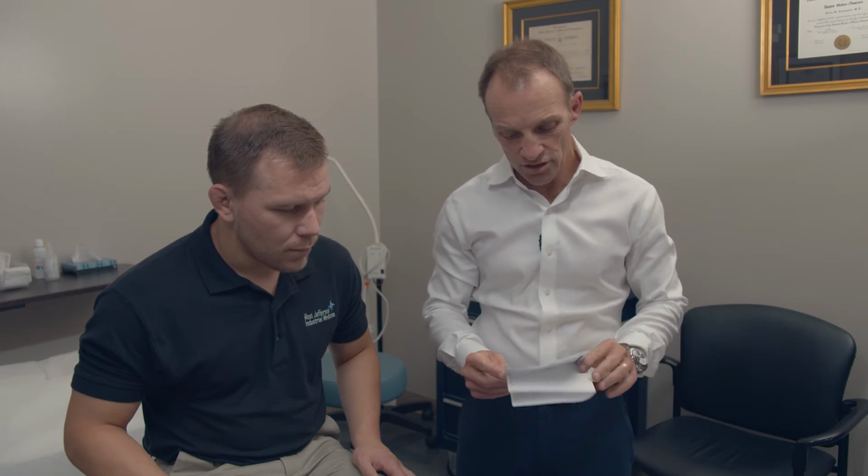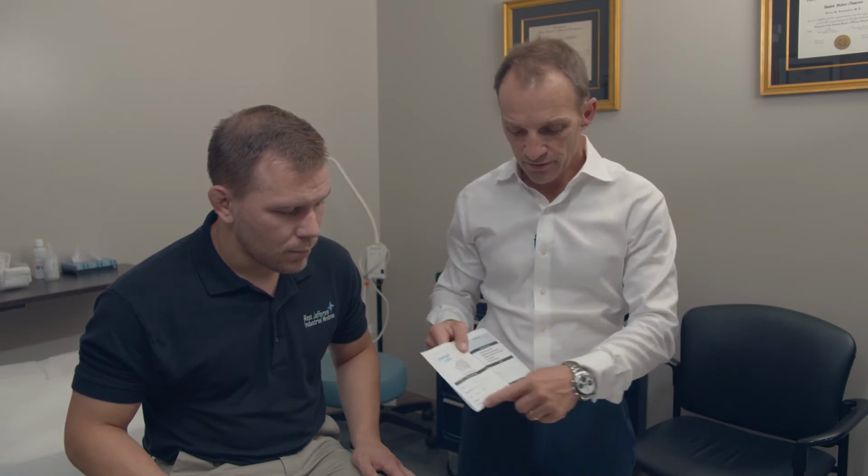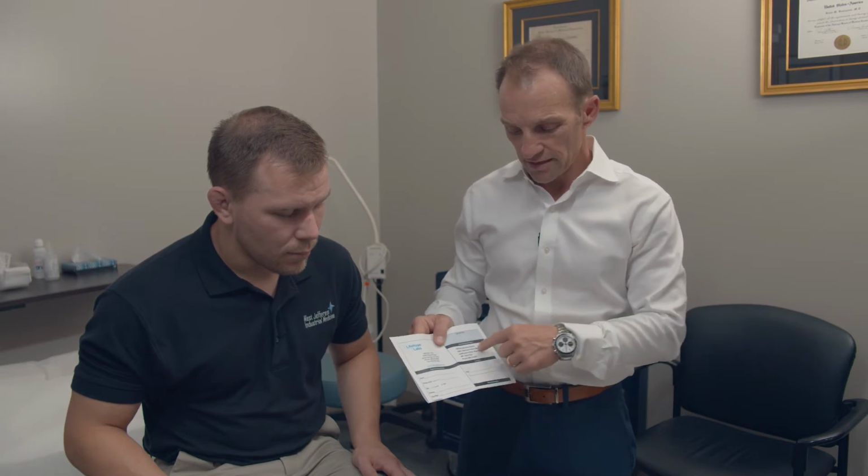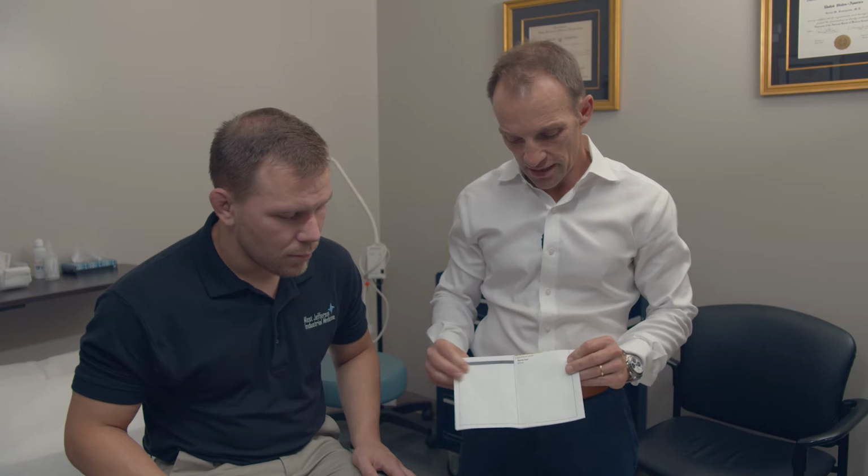This documentation is going to identify the person who the specimen is coming from. It has our return address on here. You don't need to do anything with that. And the other thing it's going to have is a label that we're going to affix to this. So let's get started.